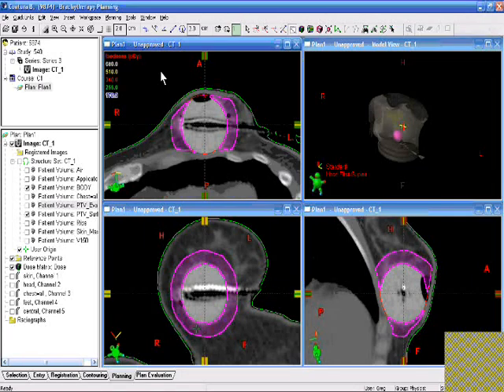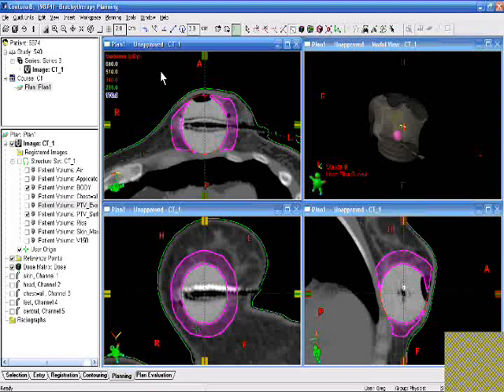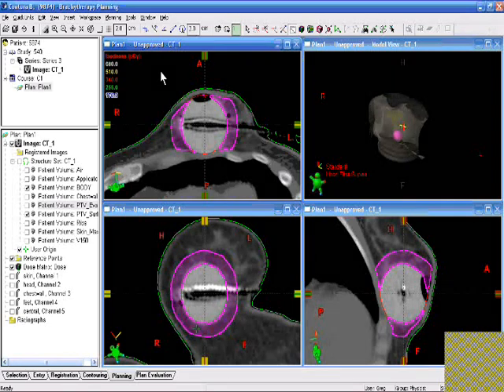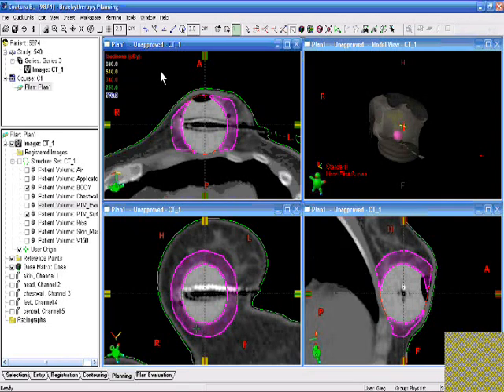But because of that, in order to make all of the arms comparable when they were evaluated centrally, they placed that as a standard recommendation that the PTV would be 5 millimeters from the skin. Now, in some cases, there is tissue in that region that is of interest to be treated, and that depends on the philosophy of the individual physician.